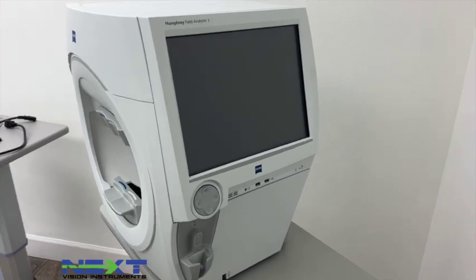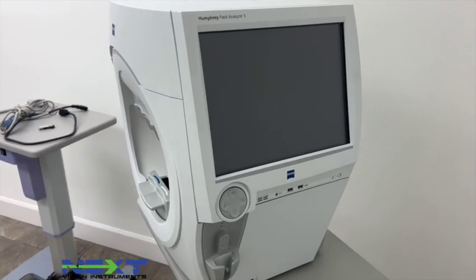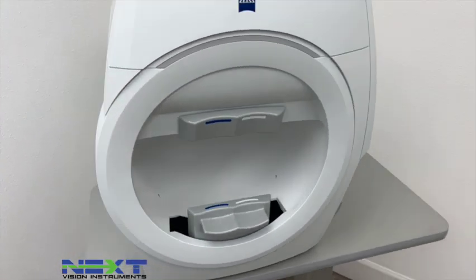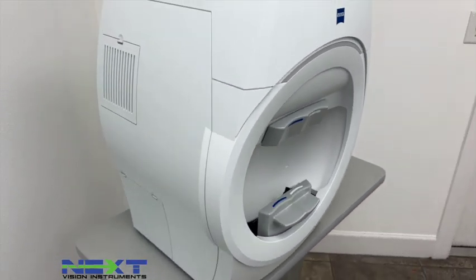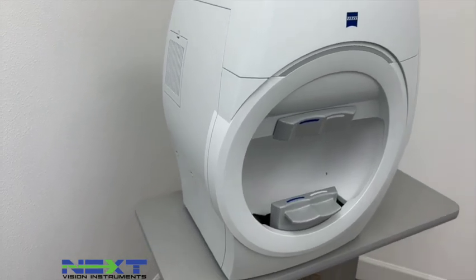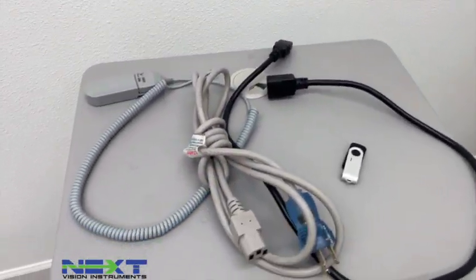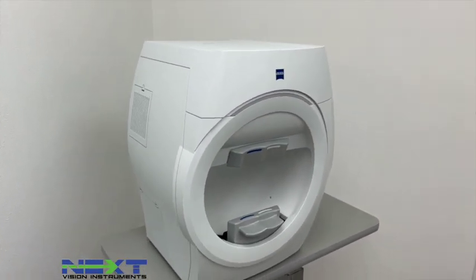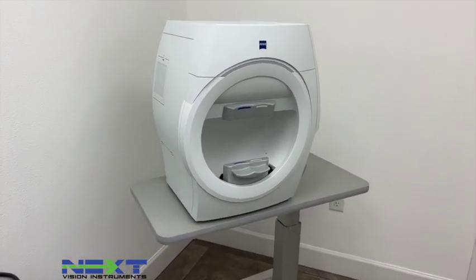Hey guys, this is Chad with NexVision Instruments coming to you again with another setup demo and operator training video. This time we are doing the Zeiss HFA 3, model 840.